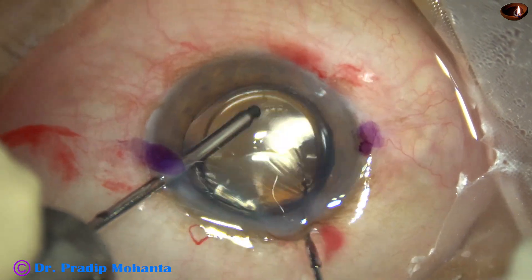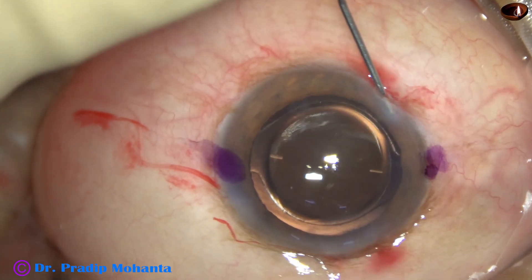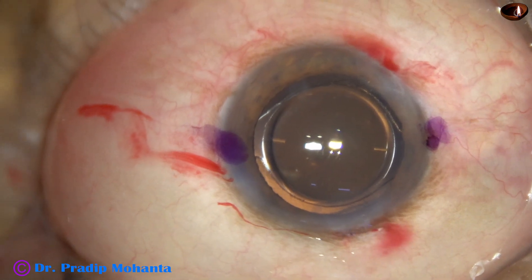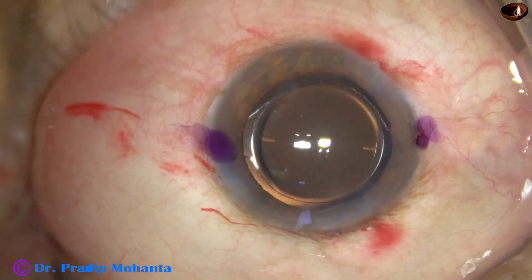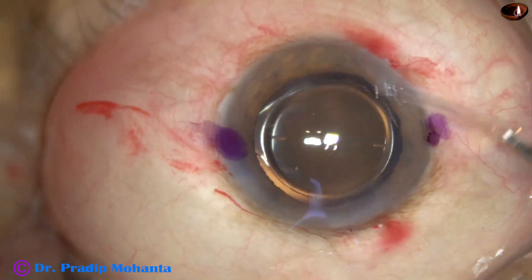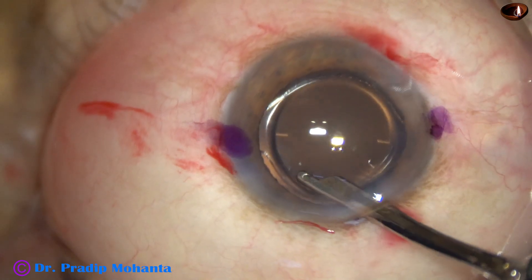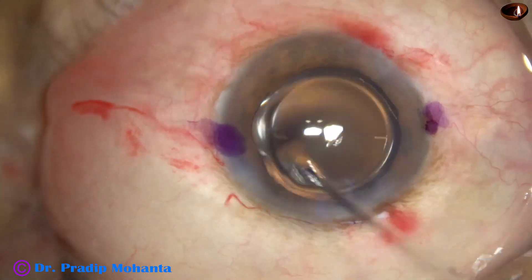The lens is nicely placed and then the side ports are closed by stromal hydration. The final lavage of the anterior chamber is done with the help of a Simcoe cannula. The anterior chamber is nicely formed and the case is concluded.